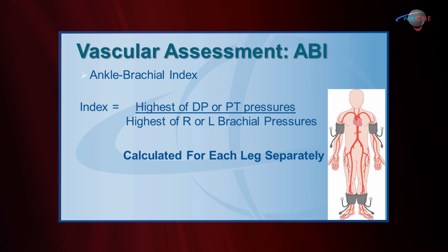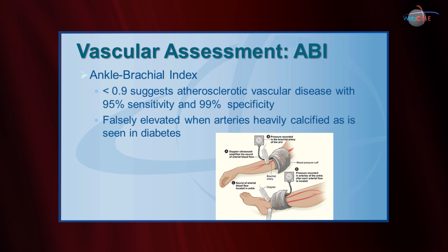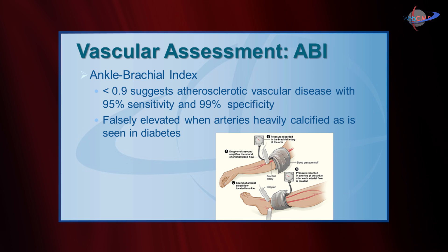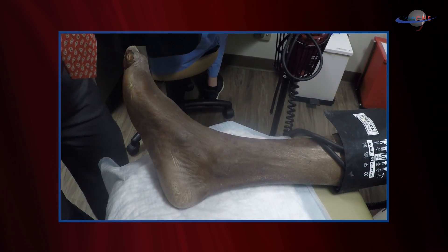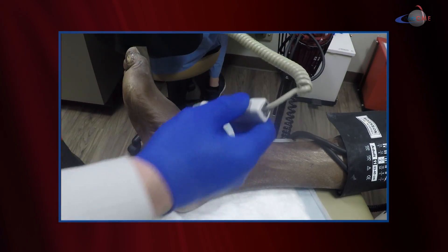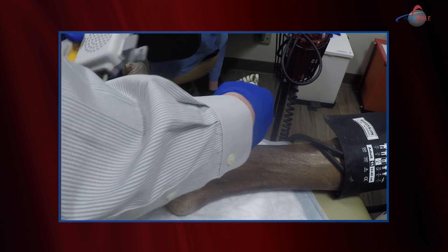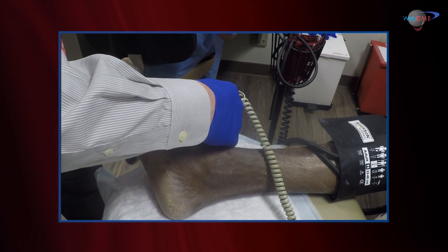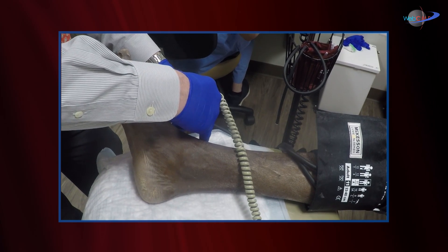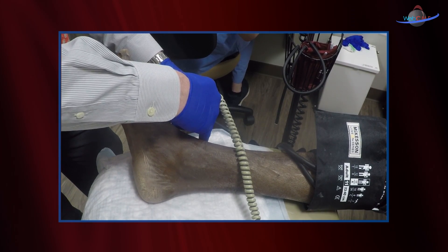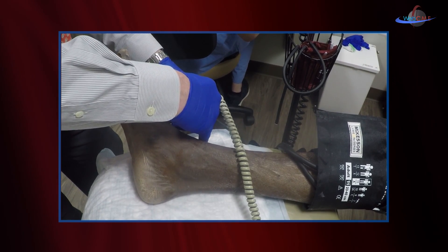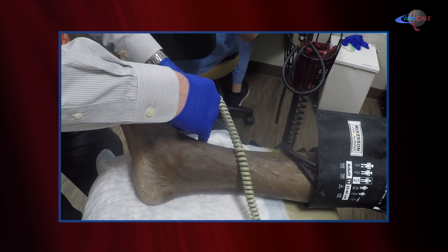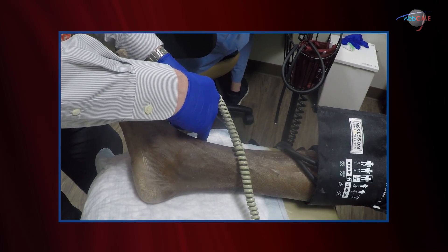We already have the blood pressure in his upper extremity. John, what was his upper extremity blood pressure? 110 over 65 — 110 systolic. We're going to take the blood pressure in this leg and I'm going to use my Doppler; it's easier than palpating. Turn this on, listen to the signal, get the Doppler signal, put the cuff on, start inflating. The expectation would be that the pulse signal disappears around 110.